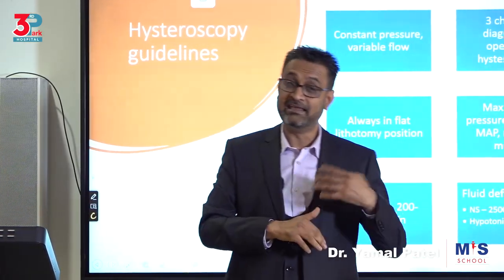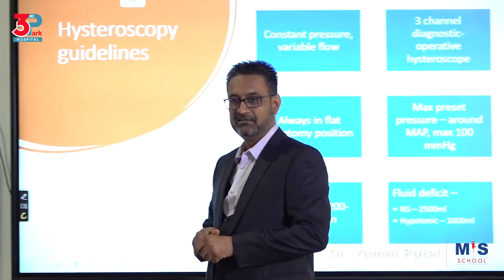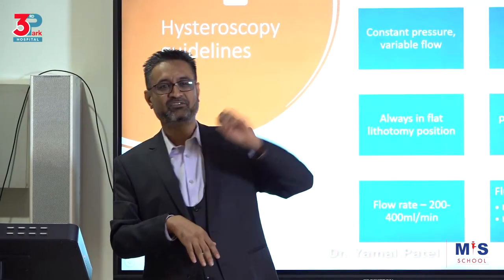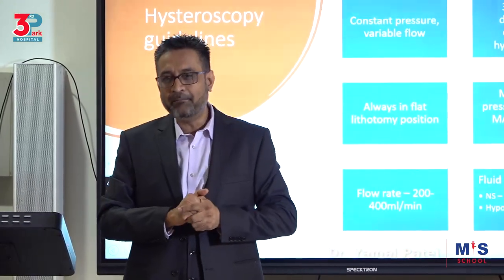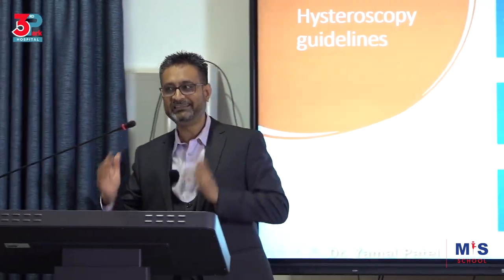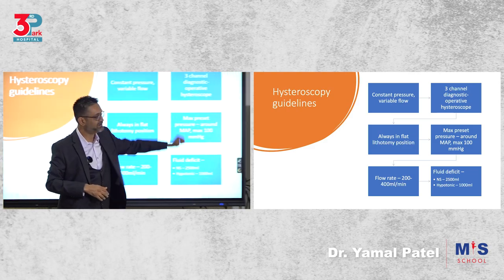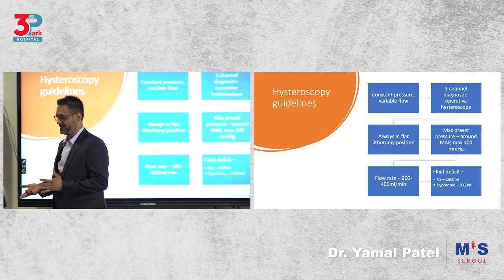The only thing that can give you that is the hysteroscopy pump. They are Histomat, Endomat, call it whatever you want. But that pump maintains a constant pressure, variable flow system. Then you're going to be using a three-channel diagnostic operative hysteroscope most times.